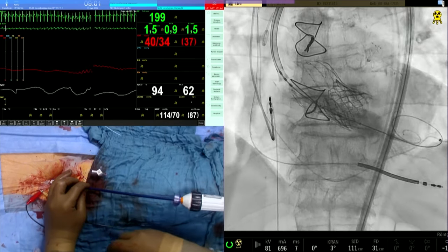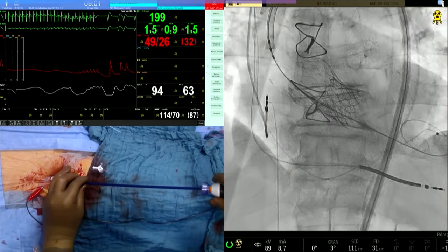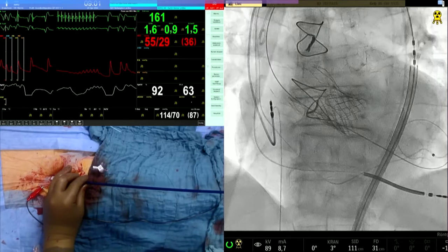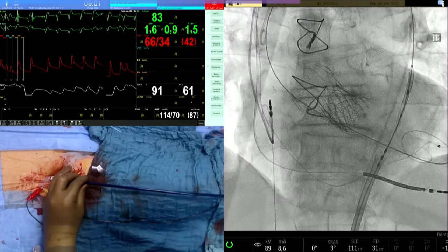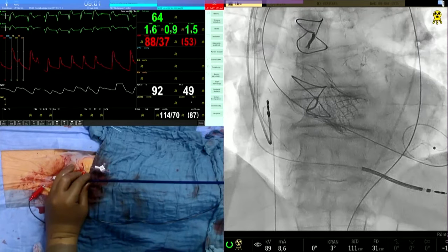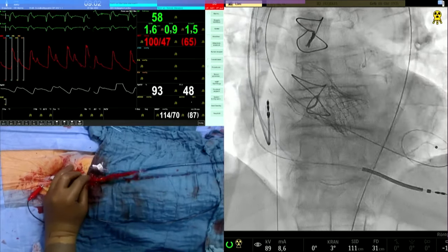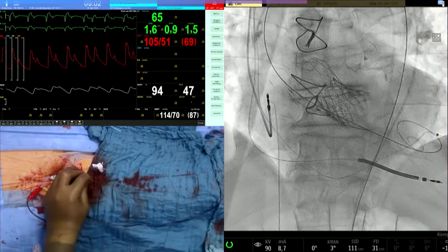Okay. Pacing off. Down, pacing off. So pressure is recovering. Patient is still doing fine. Pressure is coming. And you've seen that it remained more or less very stable at the upper portion, and it shortened from below. And I think we ended up at node 7.